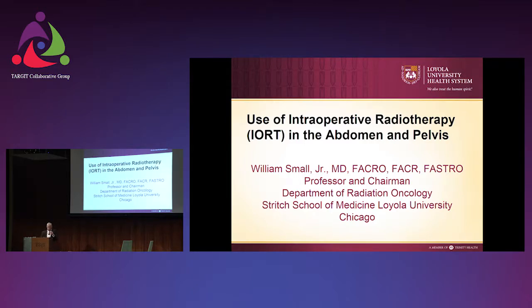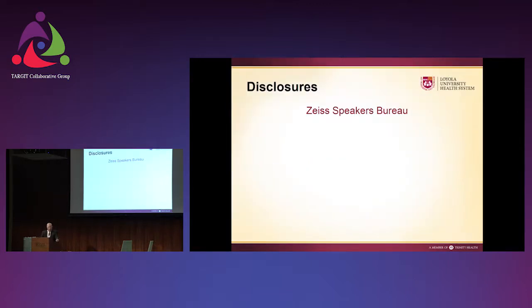Most of us don't have an operating room with an accelerator. If you do, it ties up your room for a long time. In this day and age, it's hard to do. So to me, Intrabeam is one of the ideal situations to use for this. A lot of this talk will simply be reminding people of previous IORT data, and that especially in advanced and recurrent disease, this can really have an impact.